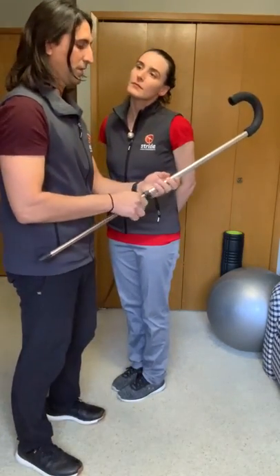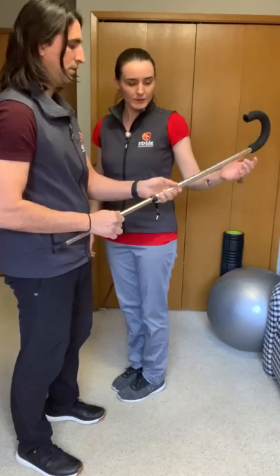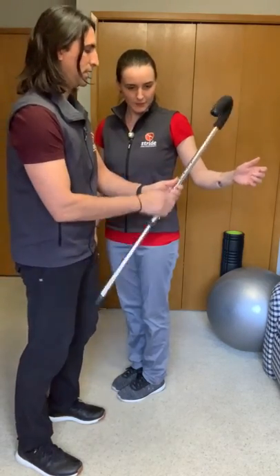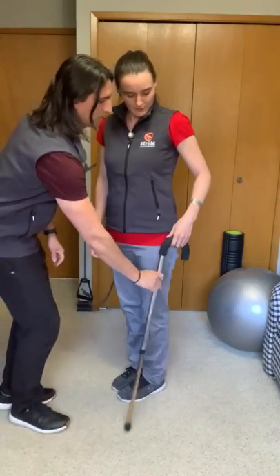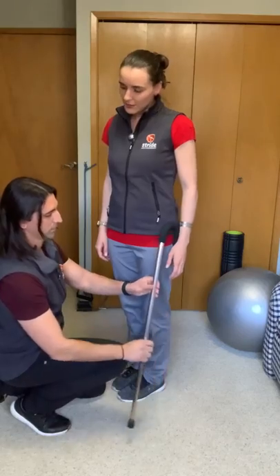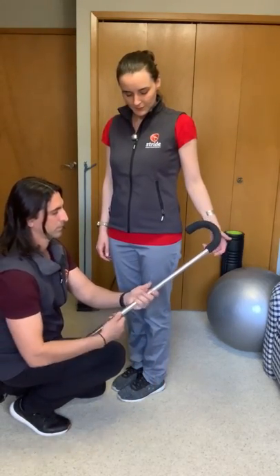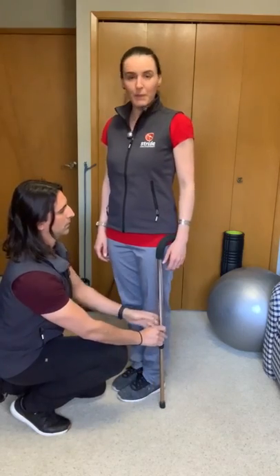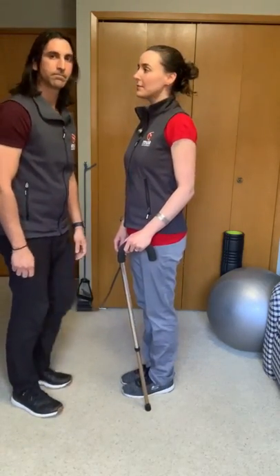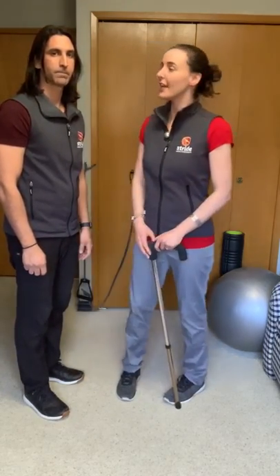We probably have to move a couple of spots. We move it down — one, two — and then let's check with the hand. Still too tall, let's do it down one more. Right there, perfect. So again, slight bend in my arm, flat and relaxed shoulders. I have a nicely sized cane.